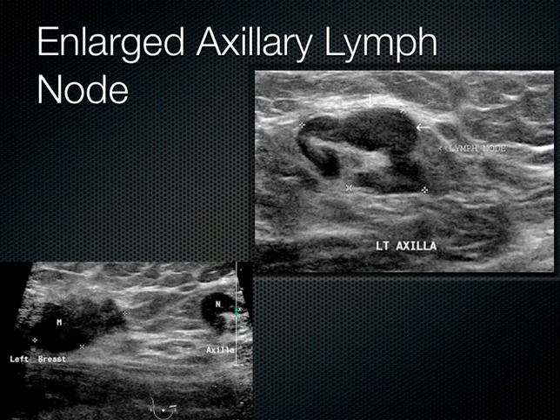And this ultrasound image here is of the left axilla in a patient who's got this hypoechoic group of lymph nodes, and the metastasis is seen here. So we can see this lymph node involvement along here, and so when you get metastases to the lymph nodes, you look up in the axilla. This is the kind of thing that you can see, this very abnormally shaped lymph node with these lobules to it. It's very enlarged.